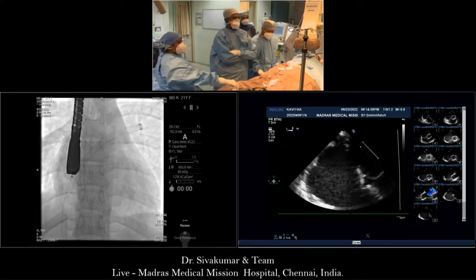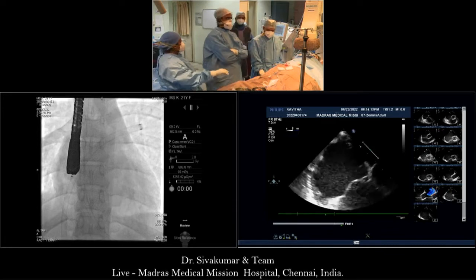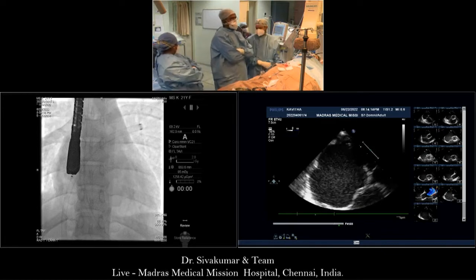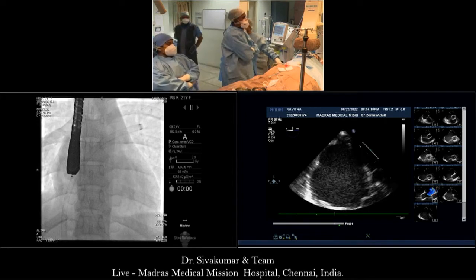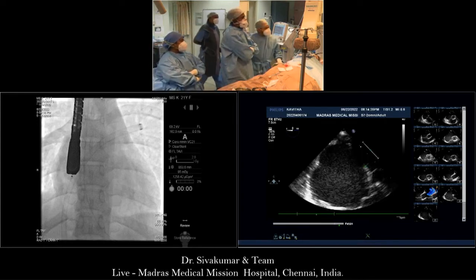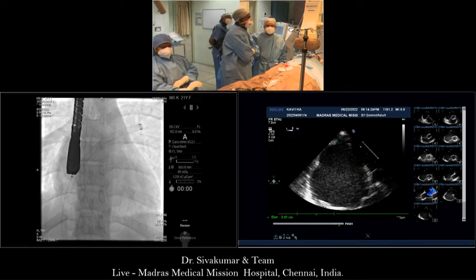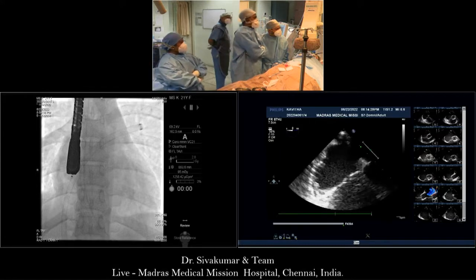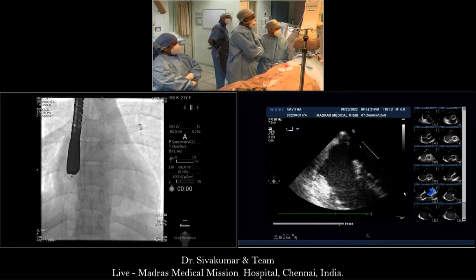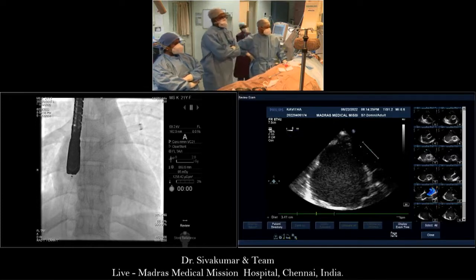Okay. So we'll ask Teji later on for his views, but go on, Jay Young. Any other questions? Dr. Rupesh Natarajan asks about experience in multiple ASDs using a combination of devices, and how different devices interact with each other. I think we'll come back to that.